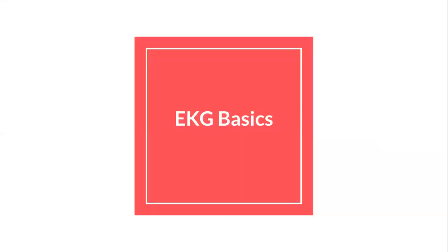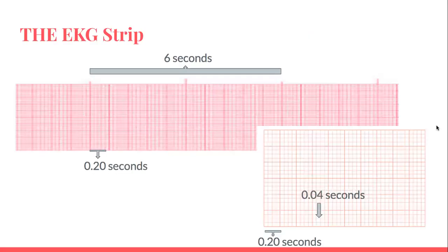Hi everyone. Today we're going to talk about the basics of reading an EKG. This is the very bare minimum basics for nursing school and is not intended to give a well-rounded review of how to read an EKG for more advanced cardiac rhythms.